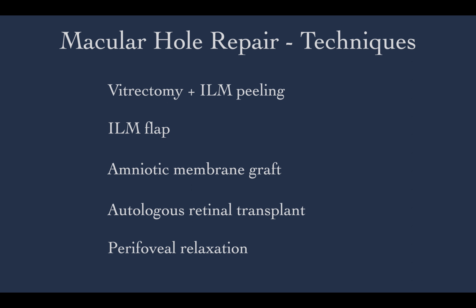Amniotic membrane graft may act as scaffold for healing of anterior segment tissues like cornea and conjunctiva, but may also have similar role in macular hole repair. Amniotic membranes may mediate gliosis and may have anti-inflammatory or anti-angiogenic properties to support retinal pigment epithelium growth and glial cell migration and hole closure.